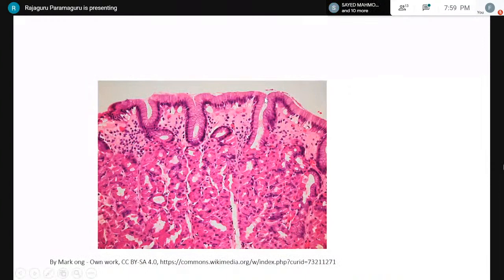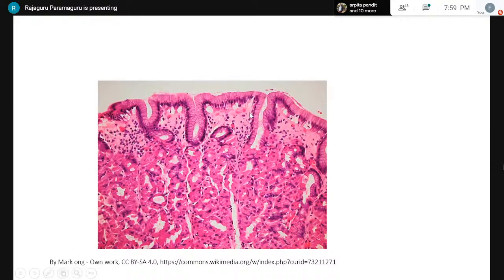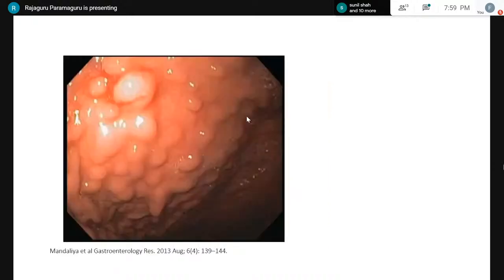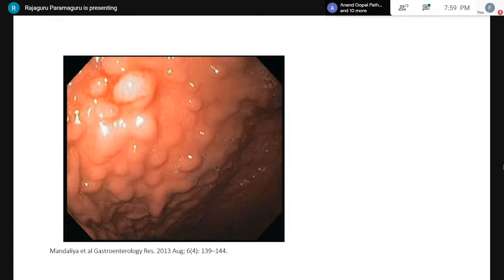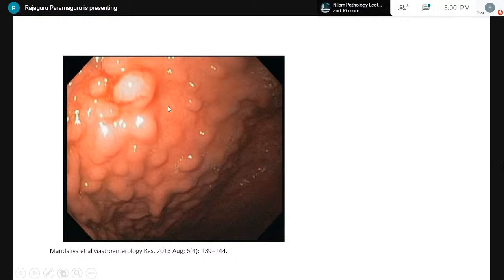This is actually acute active erosive gastritis, not collagenous gastritis — there is a lot of fibrin covering the surface with no foveolar epithelium at all, mixed with neutrophils though not clearly seen here. Collagenous gastritis is different: the surface epithelium remains intact and you have sub-epithelial collagen deposition encasing the superficial capillaries and inflammatory cells. The sub-epithelial collagen should be more than or equal to 10 microns. The endoscopic appearance is typically nodular — normal mucosa forms the nodules while the depressed areas represent collagenous atrophied areas.